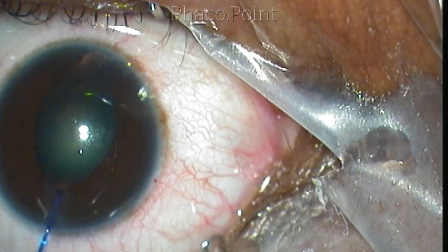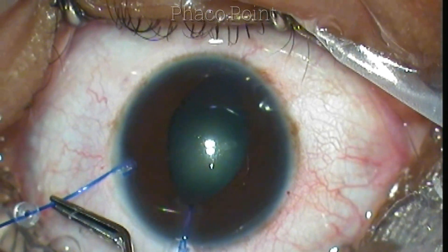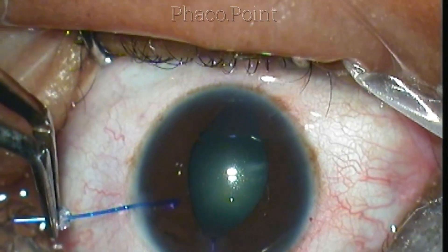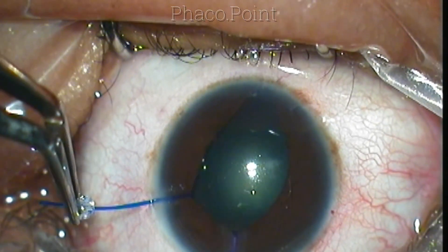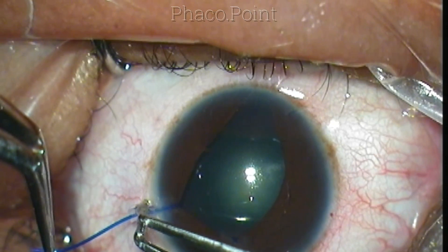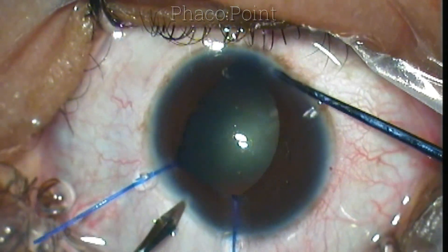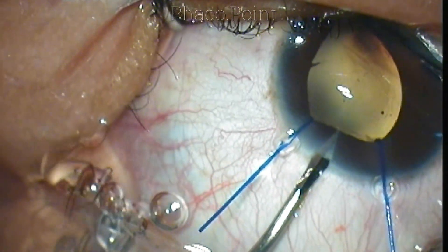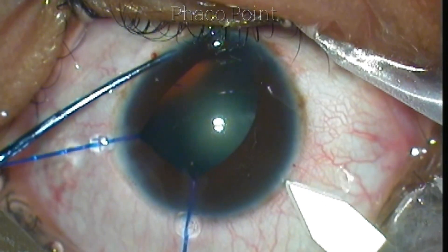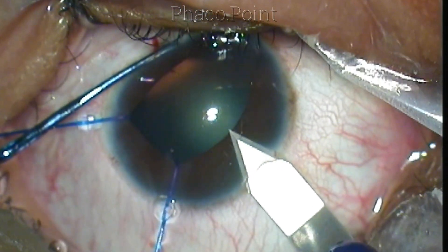With respect to iris hooks, the silicone stopper can come either as a flat stopper — which is my preference, as you can see in this case — or as a round stopper. The advantage of the flat stopper is that it is aligned with the hook of the iris hook, so you can just hold the stopper and maneuver the hook easily into place. I then make the side port incision and the clear corneal incision in my usual location around 110 to 120 degrees.